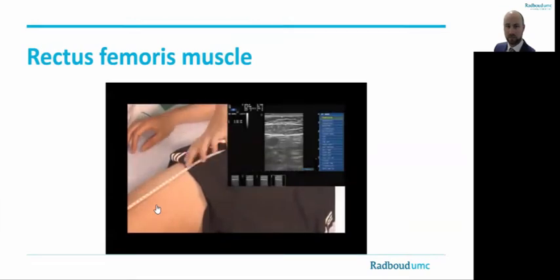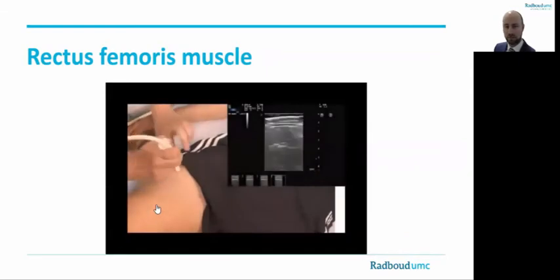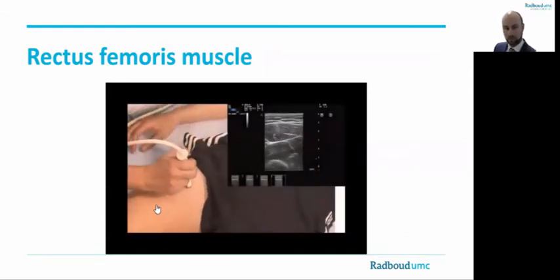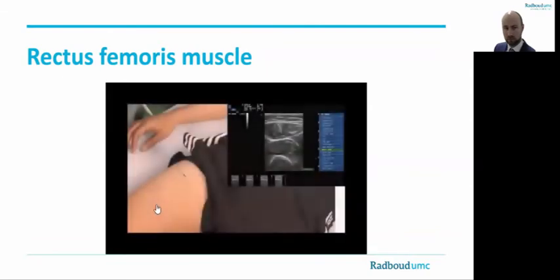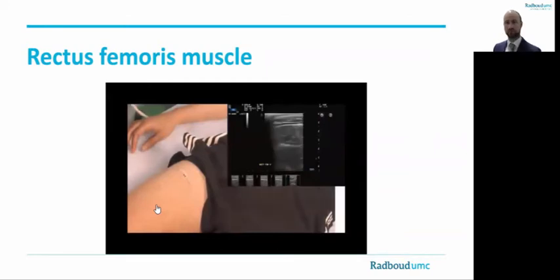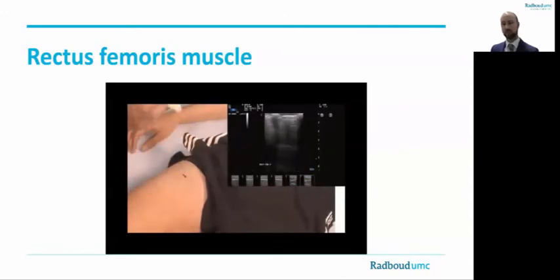The transducer is placed over the muscle in a transverse direction with the left side of the probe aligned to the left side of the ultrasound screen. Please make sure that the probe has a strict 90-degree angle to the underlying bone or fascia. You can gauge this by assessing the overall muscle image brightness — the optimal image is where the underlying surface is most bright. The image is then frozen and the corresponding annotation is added. The image is saved and stored for further offline analysis. The probe is taken off the muscle and put on again two times to capture a total of three independent images.